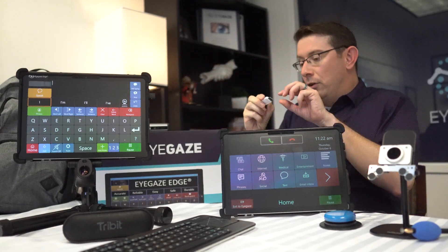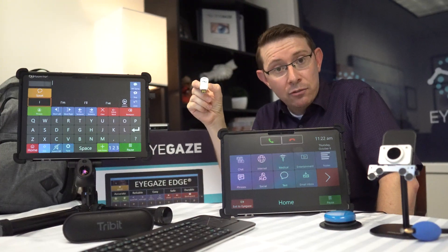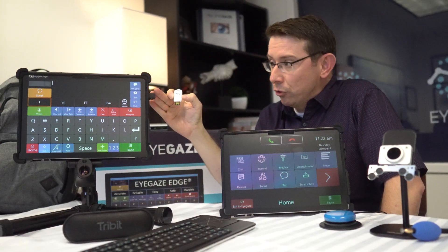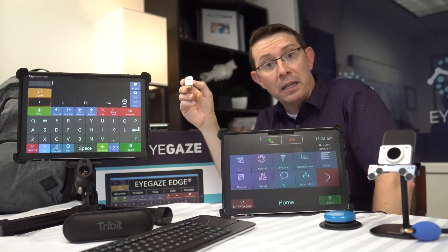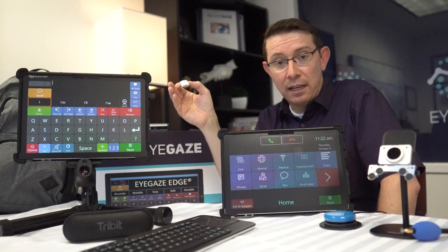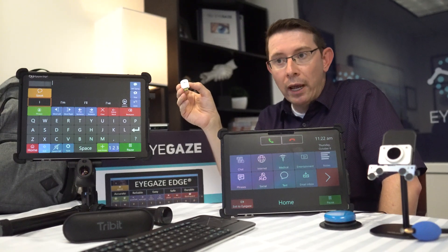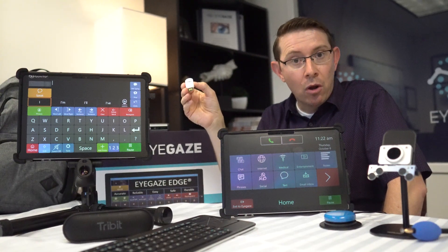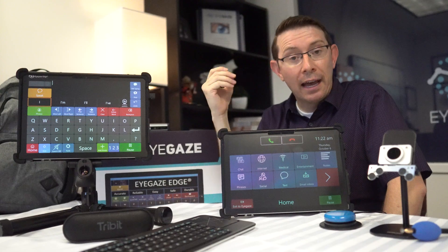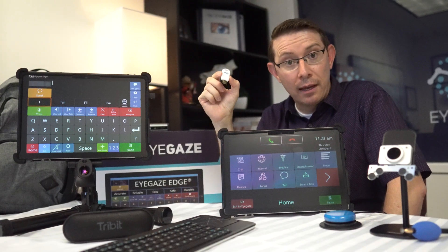This new product called the iGaze Connect comes with every iGaze Edge and allows the iGaze Edge user to control an external computer device. It could be a home PC desktop, your MacBook, a Linux system, or any other device that accepts cursor control like an iPad, a tablet, or iPhone — if you want to still access your phone and iPad apps, you can do that through the iGaze Connect.